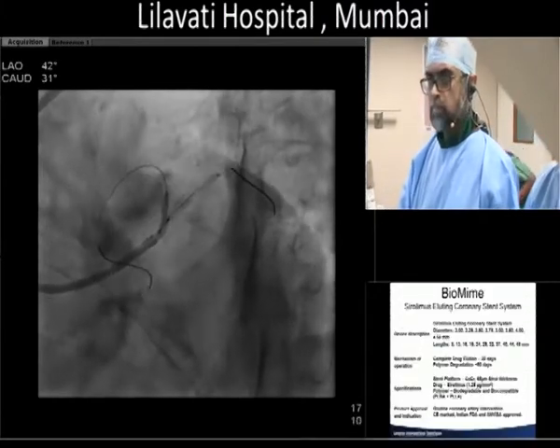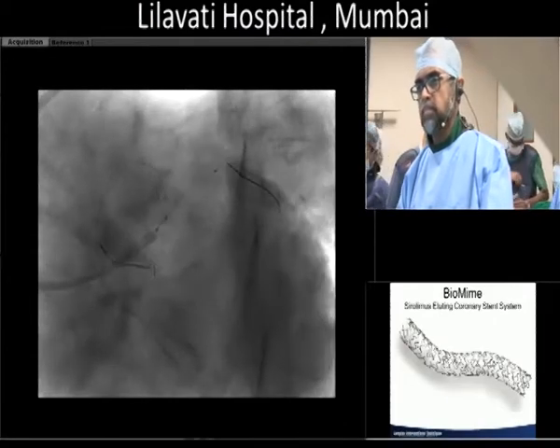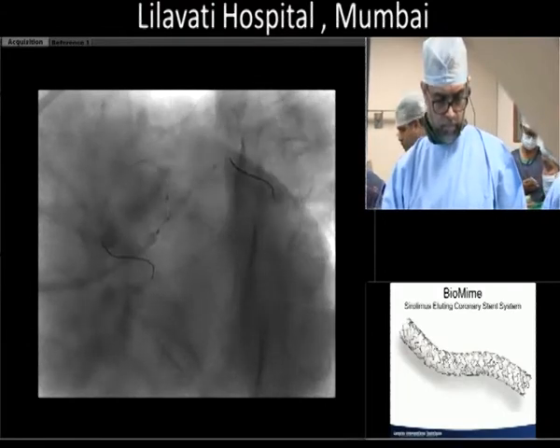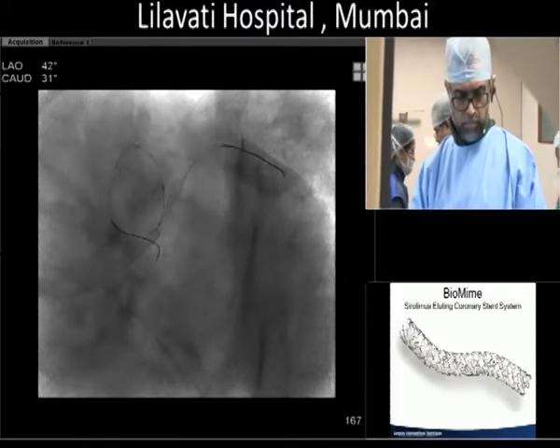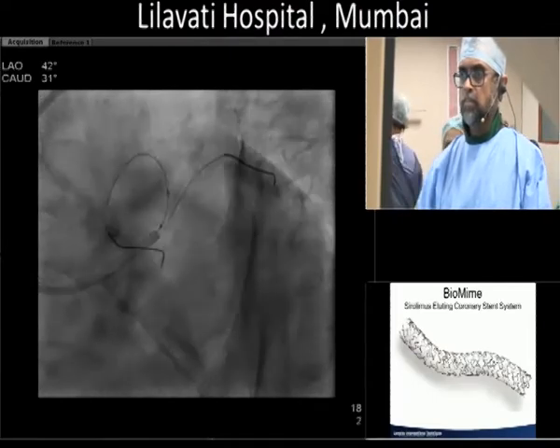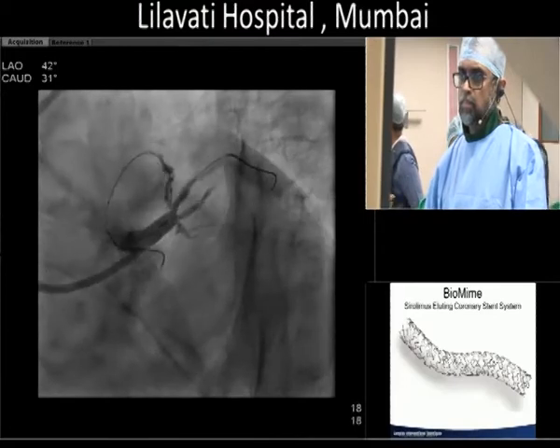So here you're making sure that when you deploy your stent and pass it past the diag, it's going to go through. If there's any struts, you want to move that out of the way. And now he's taking out the stent balloon. Get me a 2.5 into 37.